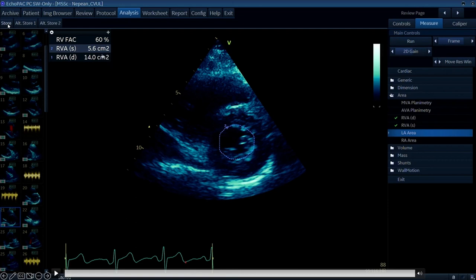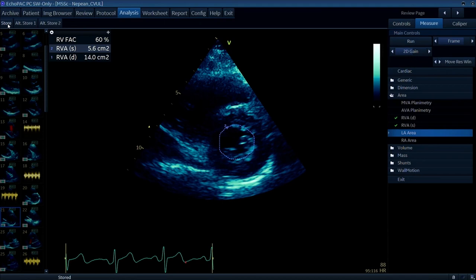We get two different areas and the change gives us a percentage - you can see here that this is 60%. The cutoff is 35, so anything less than 35 is abnormal. It's really important that your tracing is as accurate as it can be and that the pap muscles and trabeculae are all inside the LV cavity. The benefit of this is that you're seeing more than just two segments - you're assessing a cross section covering variable perfusion from different arteries, so it can potentially account for regional wall motion abnormalities.